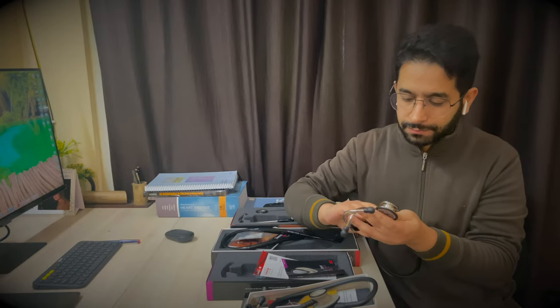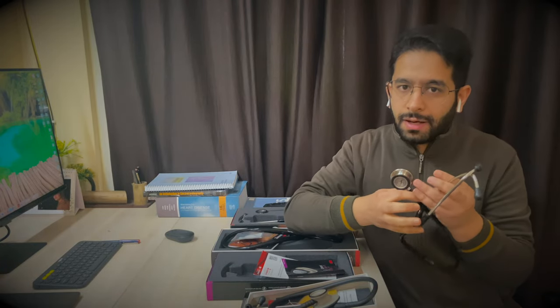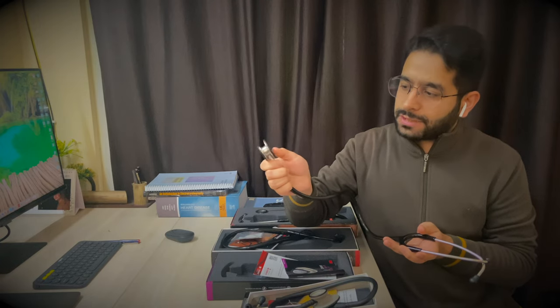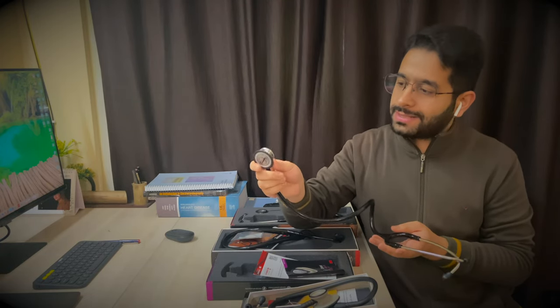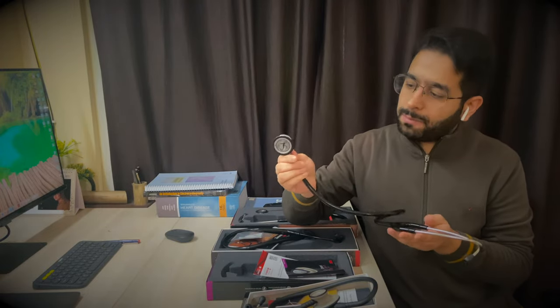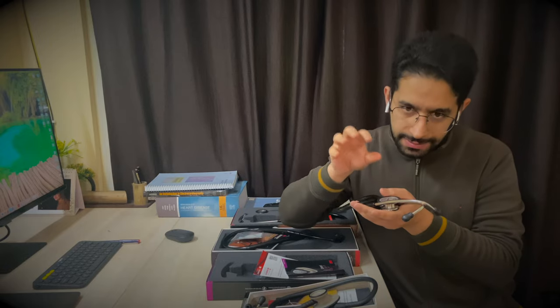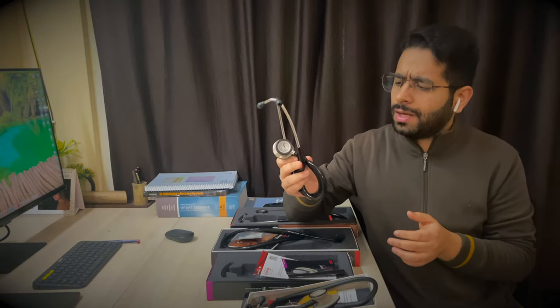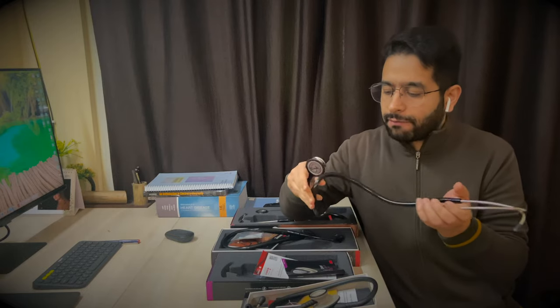Now coming to the Littmann Classic stethoscope. It comes in different variants: one meant for adults, one for pediatric patients, and a dual version which has an adult diaphragm on one side and a pediatric diaphragm on the other. There are also dedicated pediatric and infant-sized stethoscopes. This one typically costs around seven or eight thousand rupees.